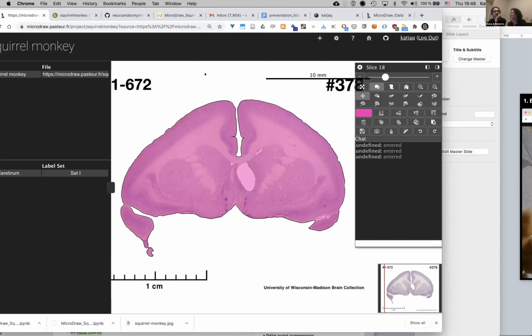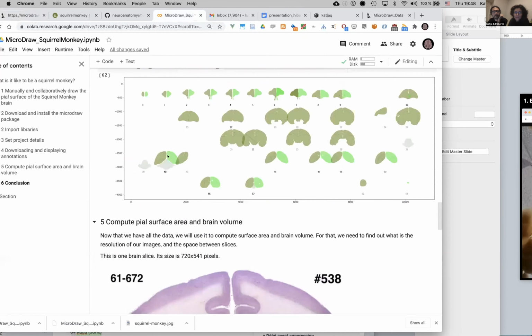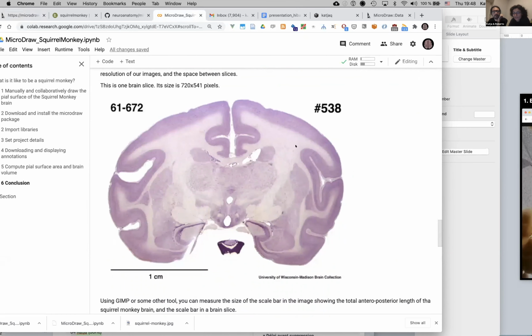If you want to do analysis on the images, for example, what we did with the giant anteater was trying to get the gray level profiles, then you need to have a version at some resolution of the data available. It should be possible to do that on the Google Colab, but I think it would be faster and easier on your local computer. What you would need is access to your data. There's nothing to install, but you would need your data somewhere accessible.